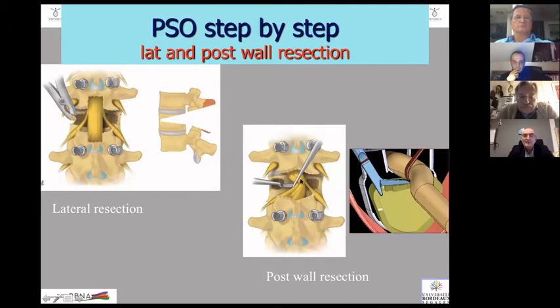This is the most dangerous. We have to go below the dura. Sometimes the posterior longitudinal ligament is quite strong or calcified. You have to be very careful when you glide this in just below the dura. You can even glide it below the ligament.